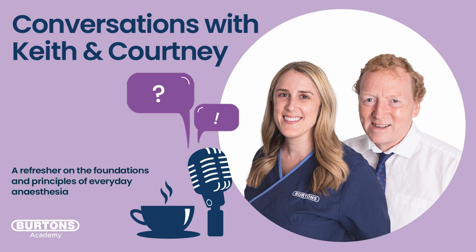Mm-hmm. I think instead of going, okay, I have this particular ventilator and this is how I use it, it is a pressure cycling only ventilator, if you get into the mindset of setting mentally those variables, or just writing them down on a notepad, your tidal volume of 10 mils per kilogram, a pressure of 10 centimeters of water, an inspiratory time of 1 second, and then your other variables like setting the respiratory rate, then no matter what ventilator you walk in to, if you walk into a room and there are 3 ventilators and they all work slightly different, you already have these variables you can apply to every single one of them. Yeah, I think so.